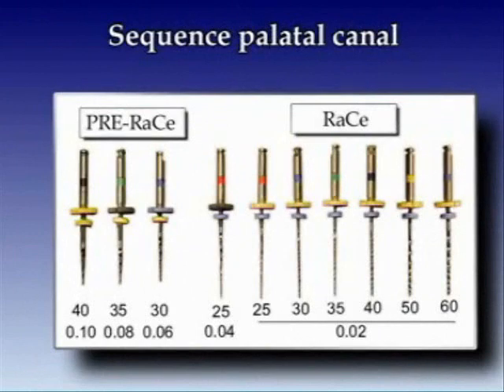We use our standard sodium hypochlorite irrigation solution as needed. In the rather wide palatal canal we prefer to use three pre-flared instruments. We plan to use one instrument with taper 04 for preparation of the middle portion of the canal, and then taper 02 instruments for the apical area, probably to size 60 in this case.